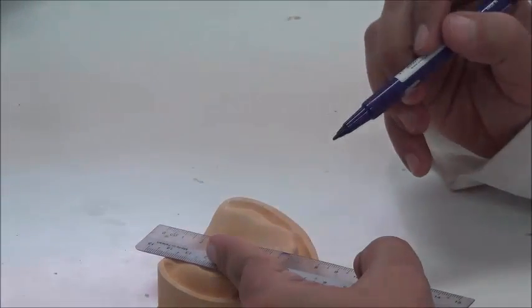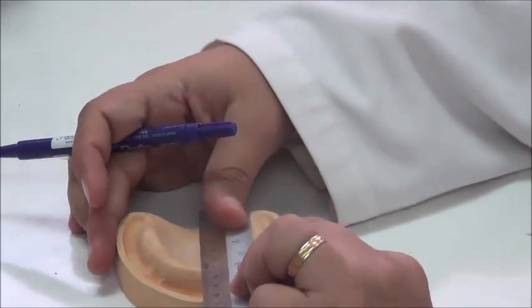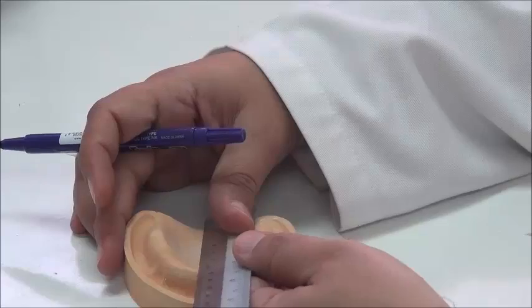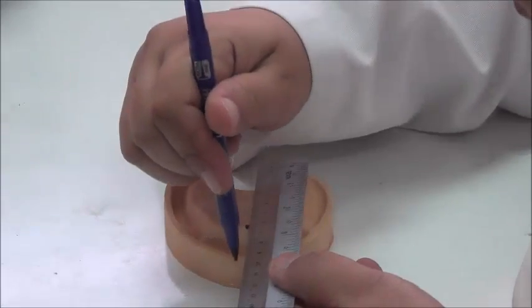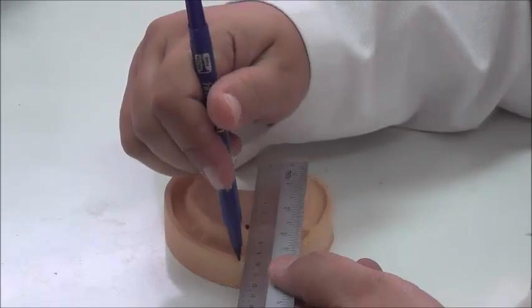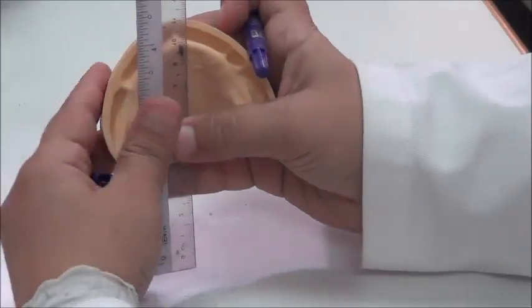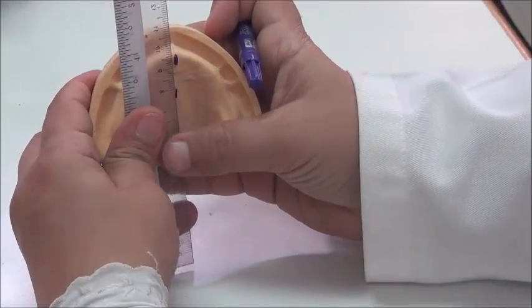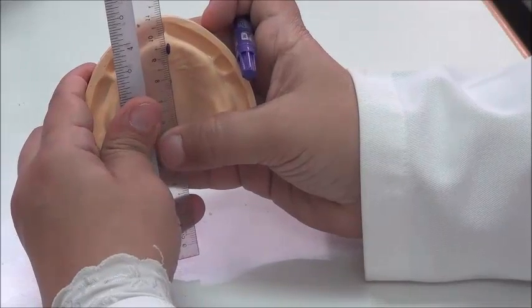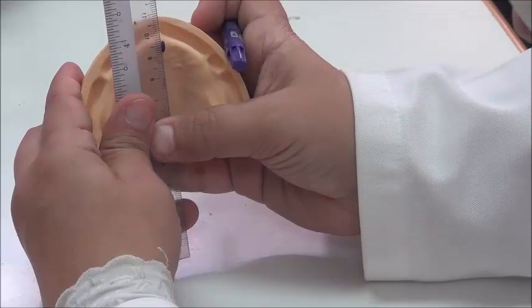and I would extend, looking from the front, maybe. I would bring this ruler over these 2 lines, and while it's in this position, I would be looking at it vertically and then run a line on the side of the cast over this. So let us just do it like this. These are the 2 lines that I have. I want to center the ruler over these 2 lines. I want to orient it in a way that's over these 2 lines.